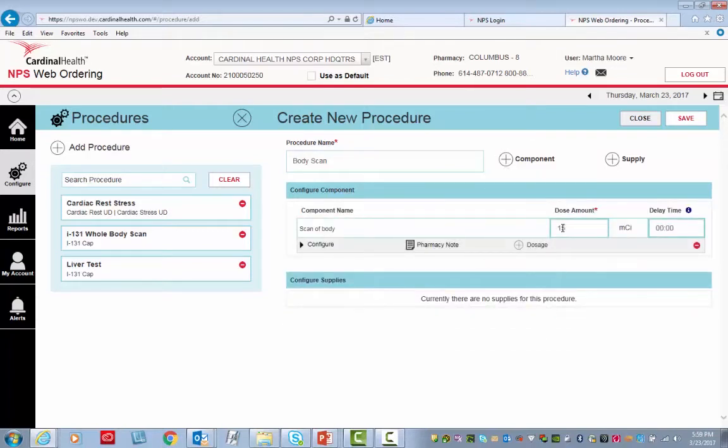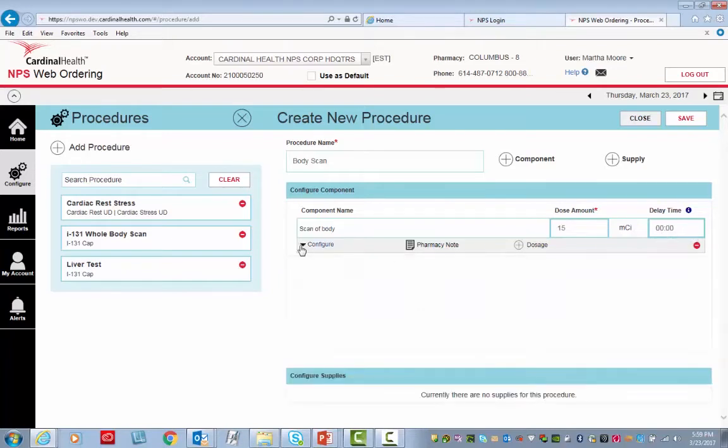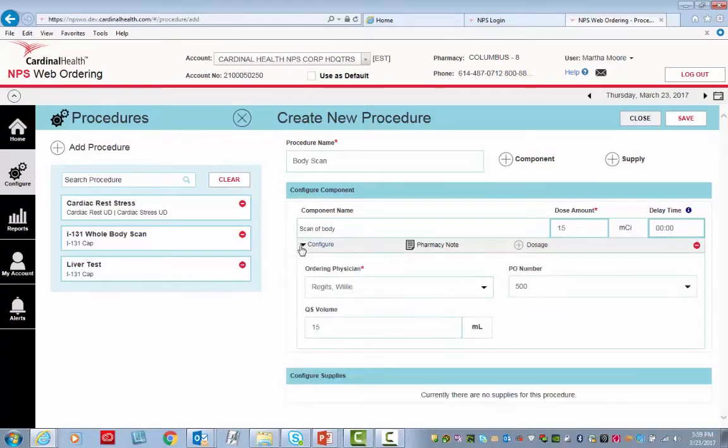Verify the dose amount and the delay time are accurate. Click Configure and either complete the fields or verify that they are accurate.